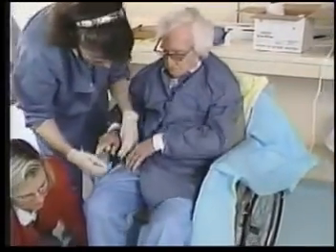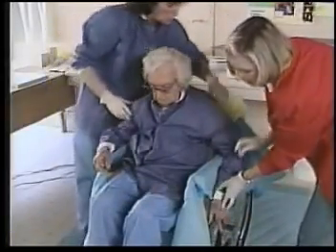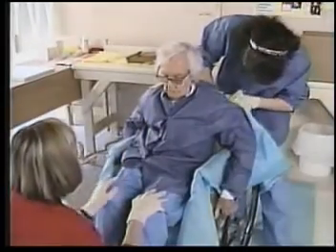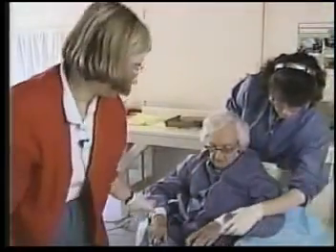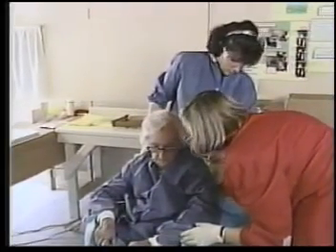The client is placed in the chair while the chemicals are still in a liquid form. The person in charge of mixing is to watch the molding bag to make sure that the foam can rise freely. While the foam is expanding, do not try to forcibly push it with your hands. Pushing crushes the delicate bubbles and creates firm, dense patches in the foam. Gently pull on the bag to adjust the foam if the sideboards don't provide sufficient guidance.